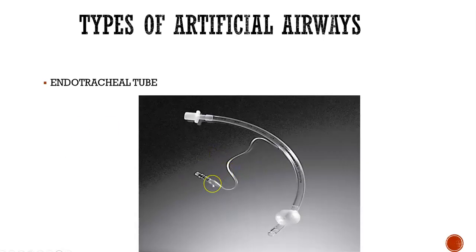So rule of thumb, especially if you're a new nurse, just don't touch your bulb, call respiratory. Because most of the time as nurses at bedside, we don't have a way to monitor the pressure cuff. And if we blow a cuff or a bulb, we got to re-intubate the patient. And a lot of the times that's a pain and a half, because once you've intubated them, you've caused trauma to that airway. So there's already going to be probably some swelling, some irritation, and they're going to be more difficult to intubate than they already were the first time. So just call respiratory. When in doubt, call respiratory.